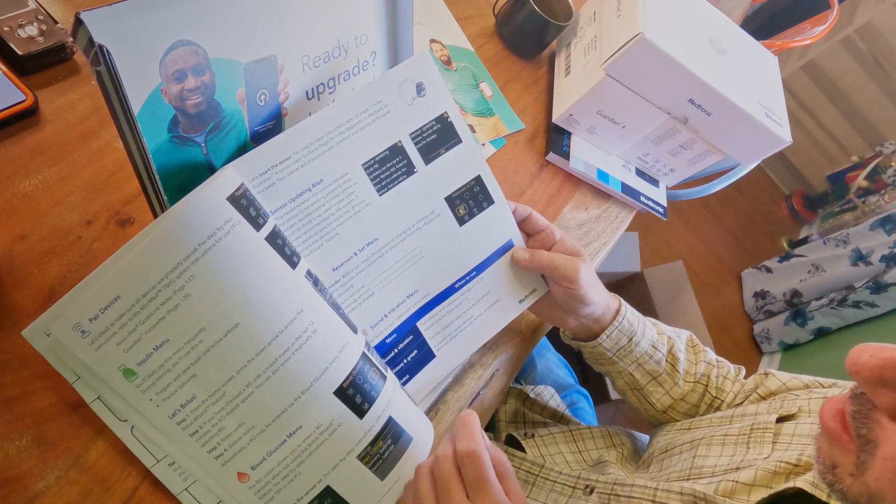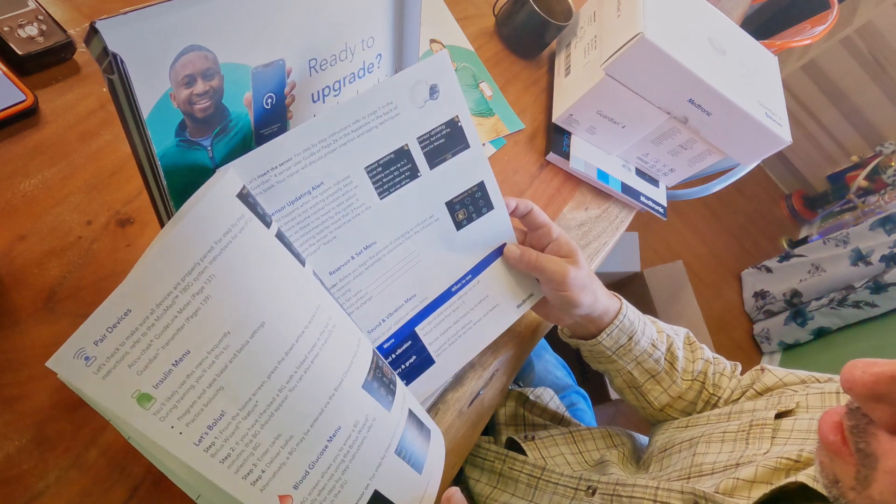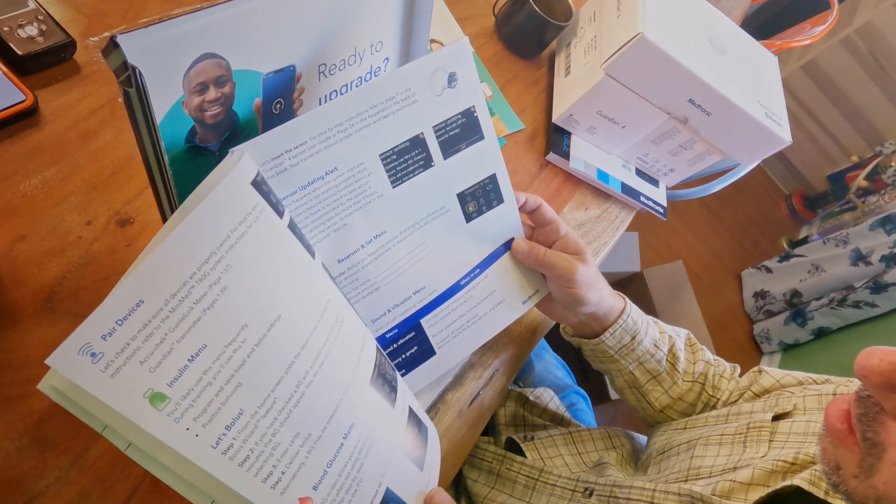I'm kind of excited, I want to get the sensor in. So that was the unboxing for the software upgrade kit.